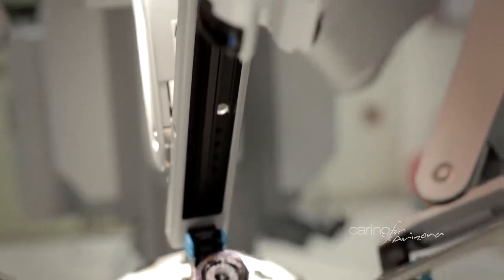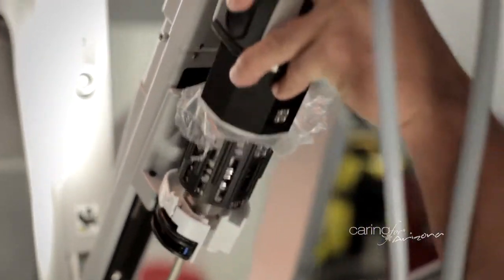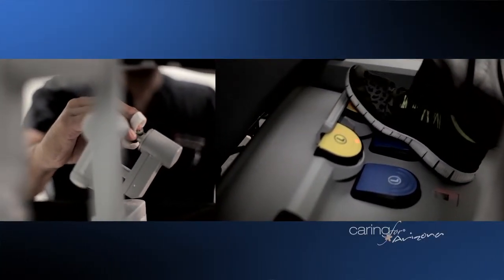Good robot cases where I think that it's useful would include incisional hernias or hernias in the abdominal wall, complex surgery, for instance, Nissen repairs for reflux problems, or repairs of the diaphragm, or removal of the spleen. Other ones would include complex colon cases, reversal of colostomy. Another area where I use the robot is to remove the gallbladder with one incision, which is great for cosmesis, and the recovery is fairly easy. I use one incision, I hide it in the belly button. The patient never sees it as it heals, and it's the same surgery, same outcome.